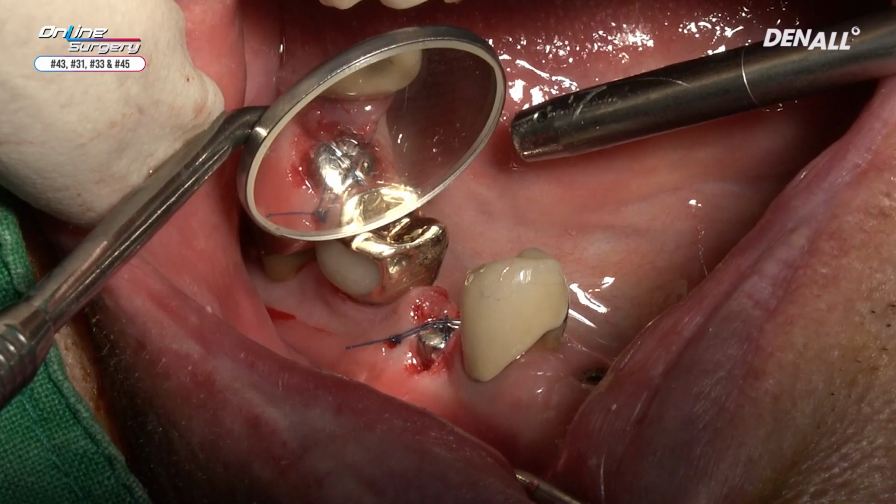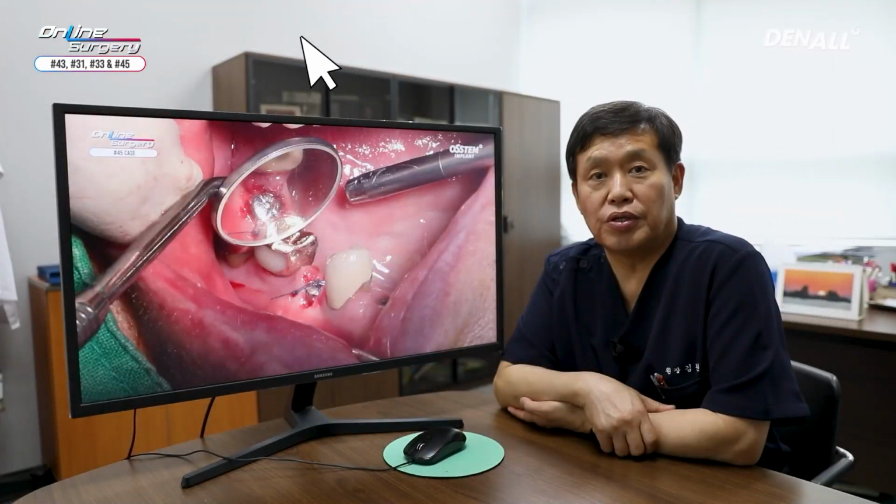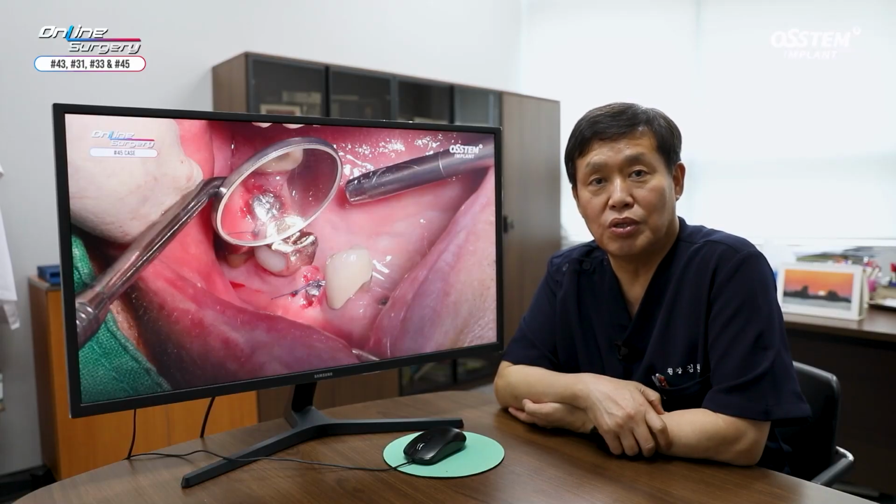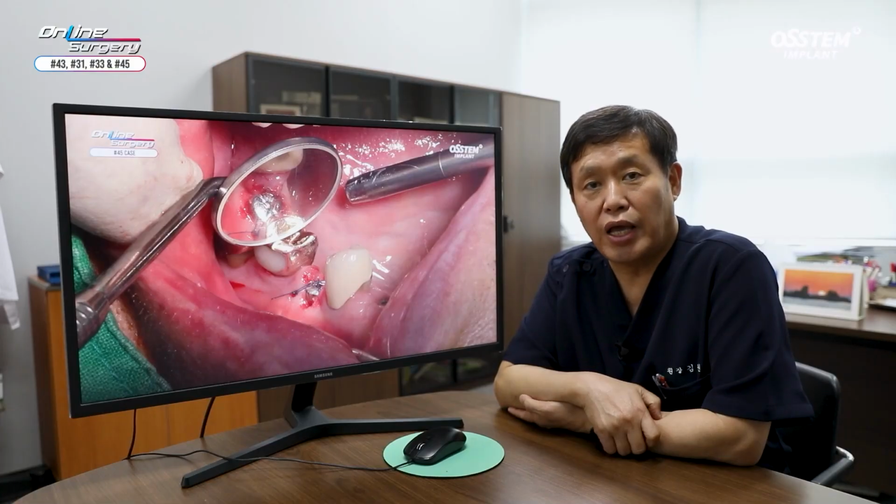Today's surgery was about immediate implant placement. What was noticeable is that in number 33, the root was 2. It's not an unusual case. There was transposition with premolar. I decided to reduce the implant diameter, and in the buccal defect area, A Oss Collagen was used.